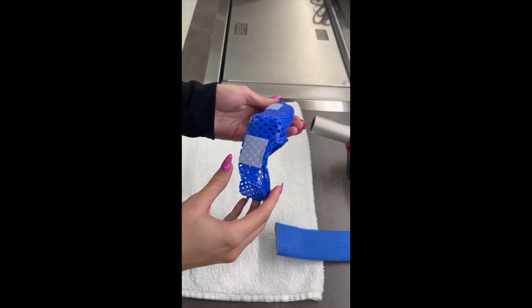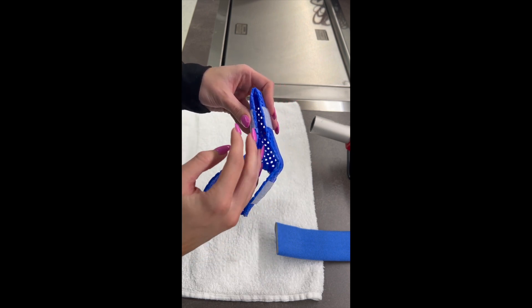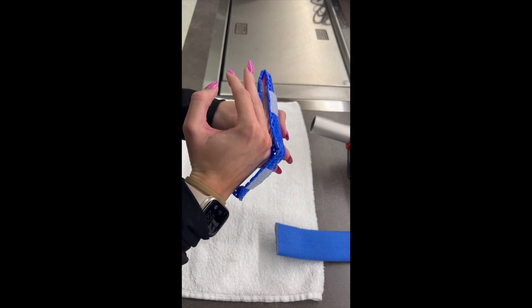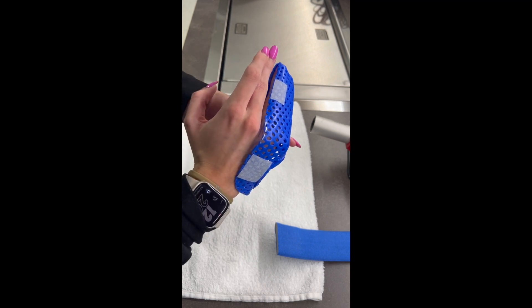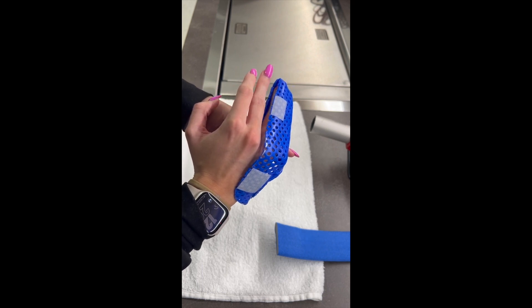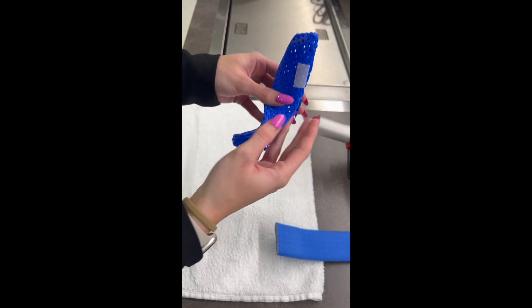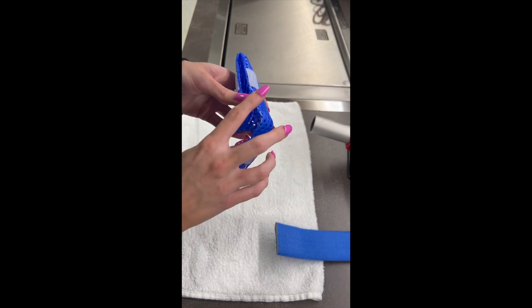Here's the orthosis after it has been trimmed. You want to open up the area between the included digits and the adjacent digits so it does not limit or rub against the adjacent finger. On the sides, bring them straight down and then round the corners.